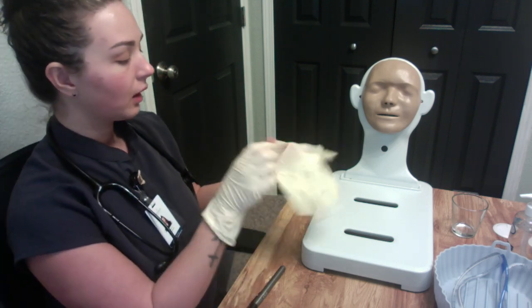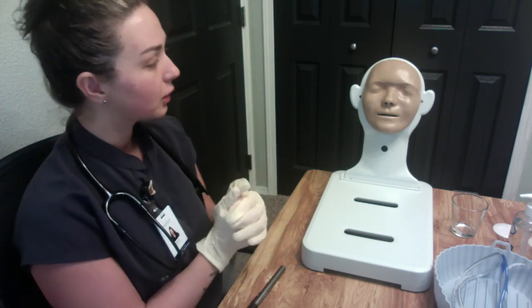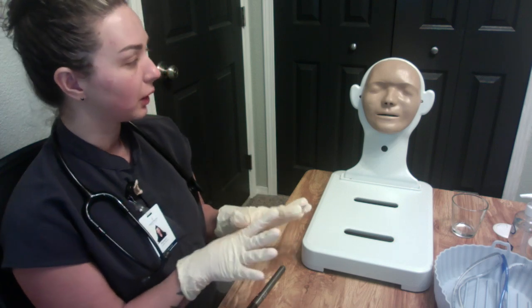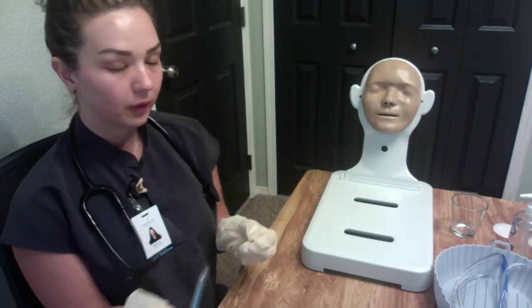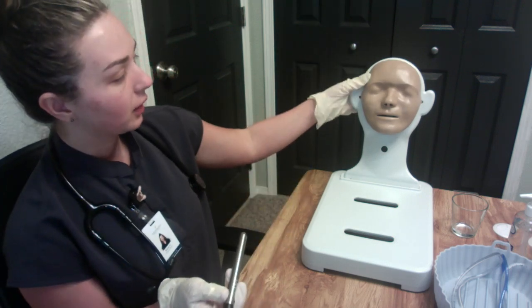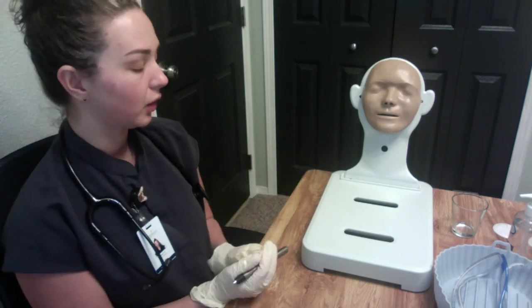Okay, Mrs. Smith, as I insert this, we're going to be inserting the tube in through your nostril and down the back of your throat into your stomach, okay? I know it sounds a little bit scary, but we will make sure that we take really good care of you, okay? So first, before we insert, we want to check the patient's nares and figure out which one is going to be best suited for the patient.